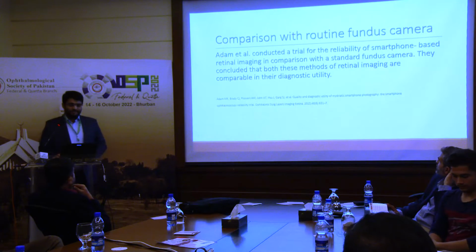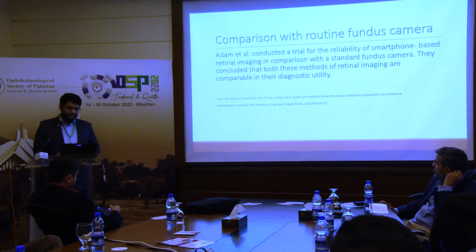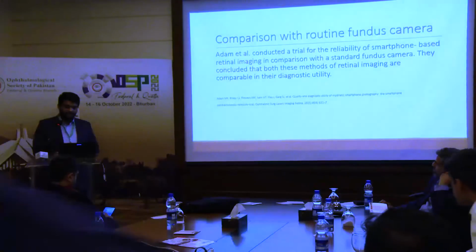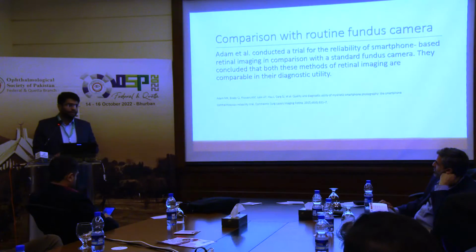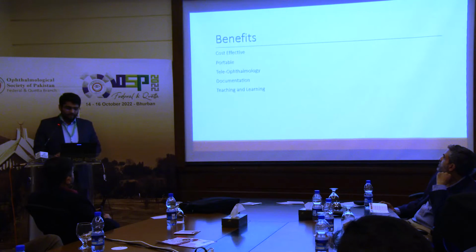Different studies which have compared the quality of these pictures with standard fundus photographs have shown that these pictures are reliable and can be used for diagnosis as well as for teleophthalmology, in which we can send the pictures to our professional colleagues and VR fellows, who can give comments and then we can manage or refer the patients. The most important benefit of this technique is that it is cost effective and portable. I have used it myself to screen ROP children in the NICU, where a fundus camera or even an indirect ophthalmoscope is sometimes not available.